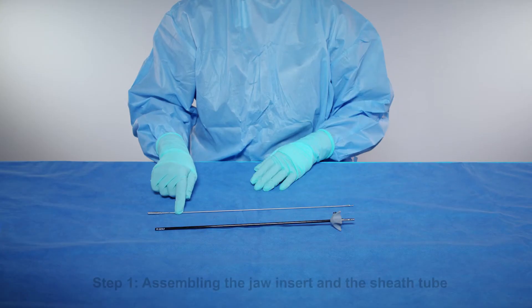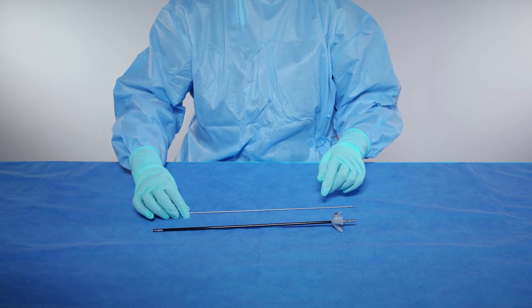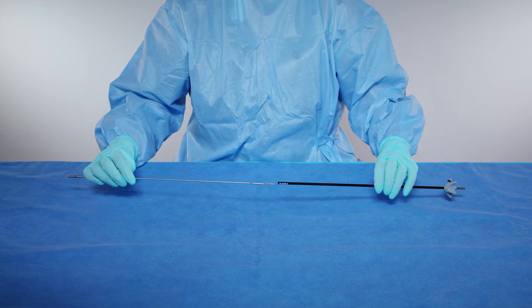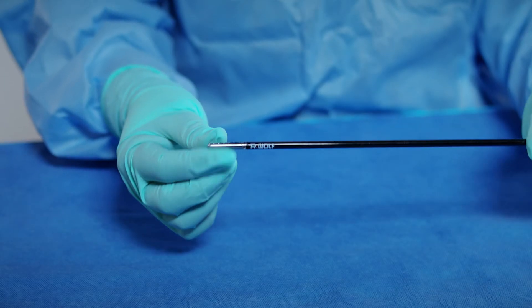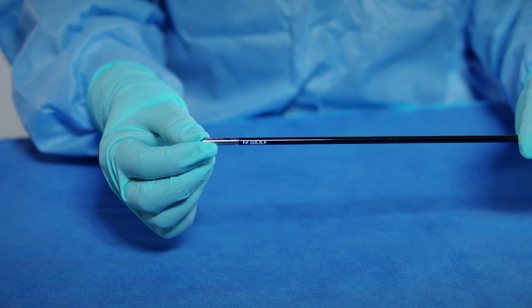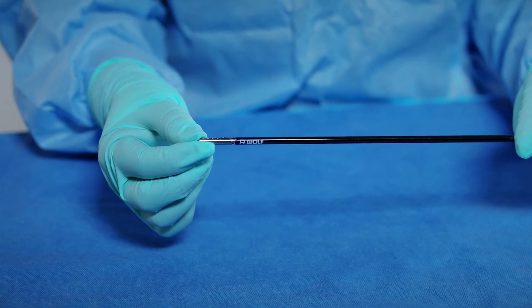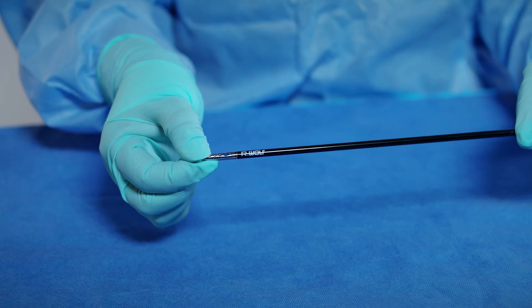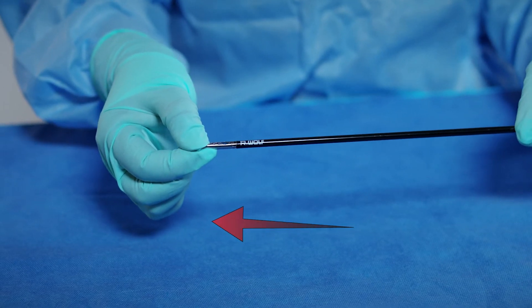Step 1: Assembling the jaw insert and sheath tube. Pick up the jaw insert and sheath tube from the back table. Guide the jaw insert into the sheath tube. Once the jaw is inserted into the sheath tube and is fully seated, grasp the tip of the closed jaw insert and gently twist away from you or clockwise to lock in place. Then pull on the jaw tip to confirm it is loaded in place.